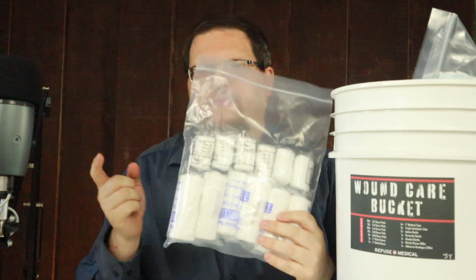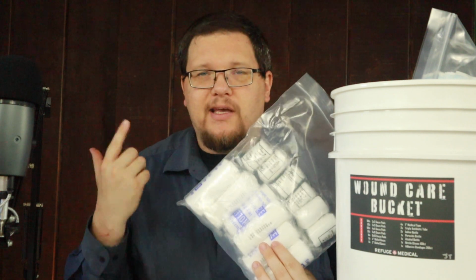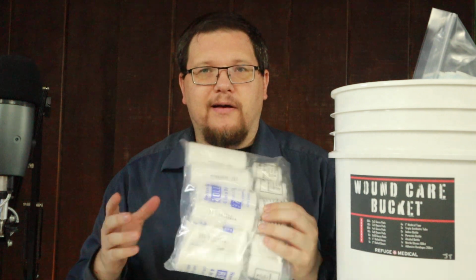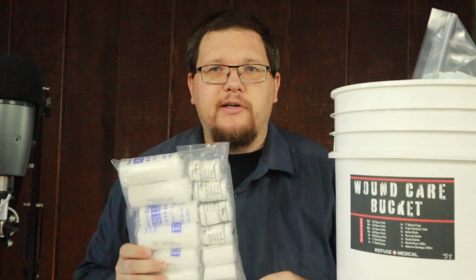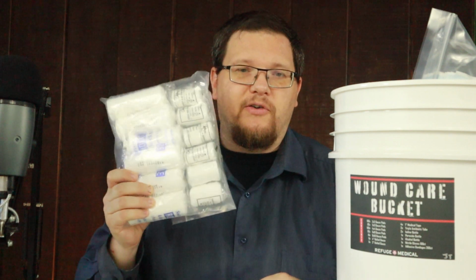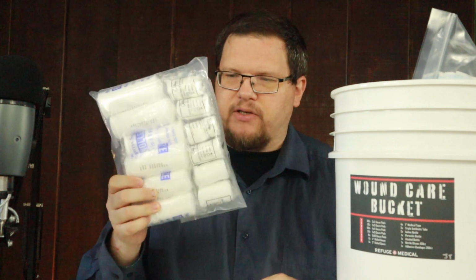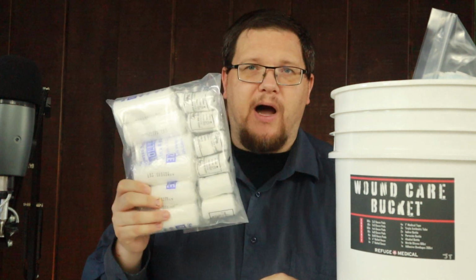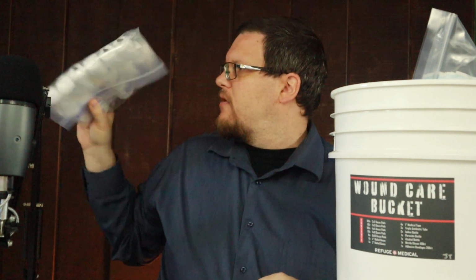So when we get into rolled gauze and stuff like that, you're going to need these in your first aid kits. So your individual first aid kit, like IFAK. So if you do have a kit of boomsticks and all that stuff, if you ever use any of this, you're going to need to replenish your gauze. This doesn't really cost all that much, but you can get this pretty cheap out there, and I recommend even getting more boxes of rolled gauze because that's really useful stuff.